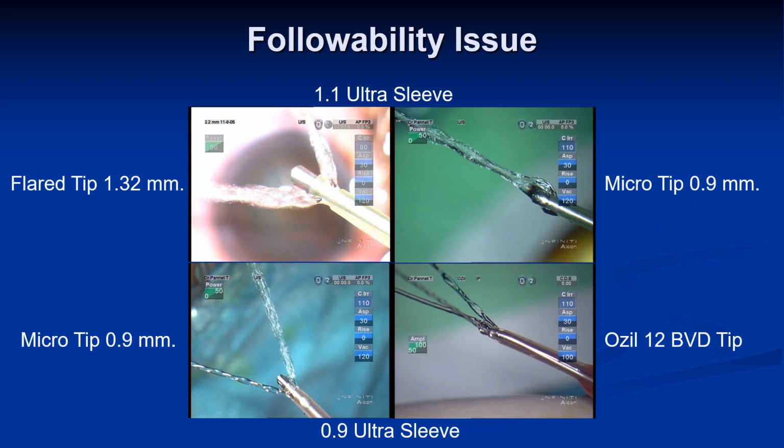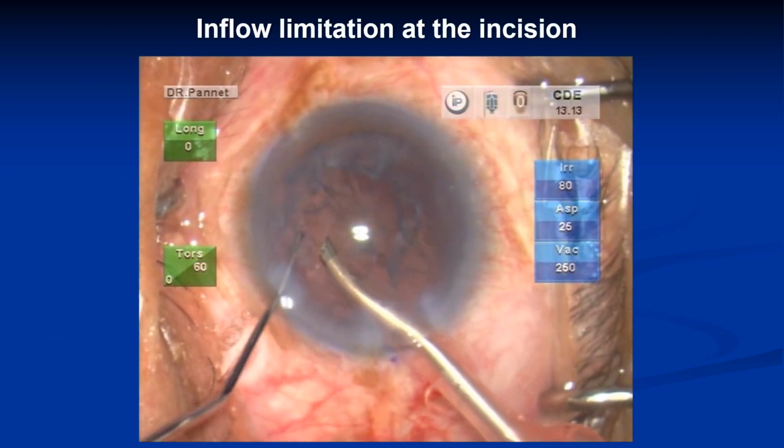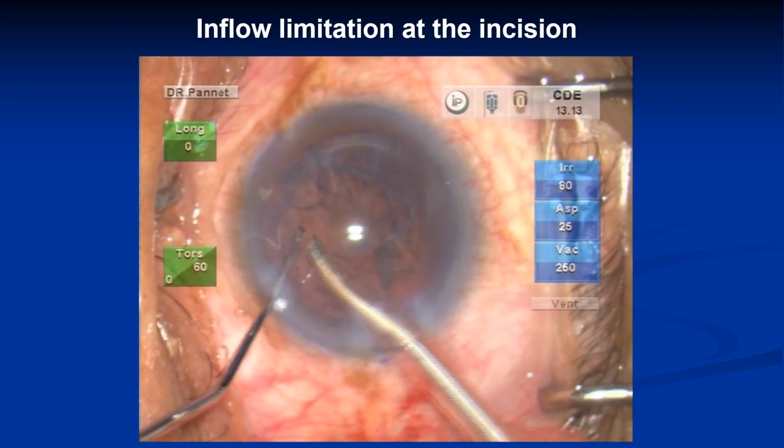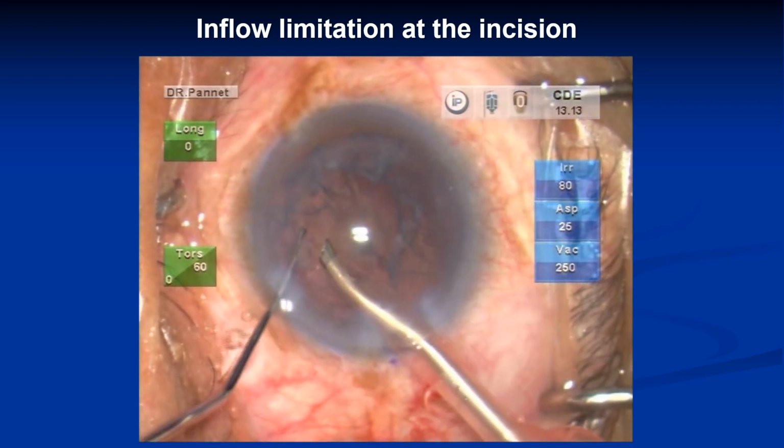The picture on the right shows a forward fluid stream that may push the segment away. Angling the tip and sleeve to either side may also reduce inflow because of constriction at the incision. We can observe AC fluctuation.